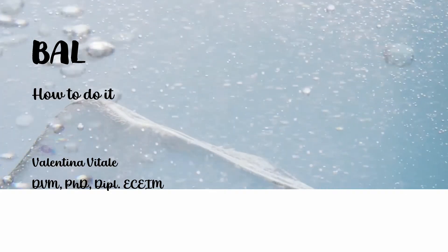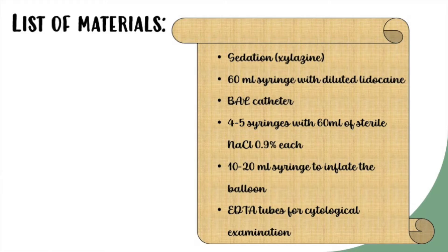So now, first of all, let's check what we need: adequate sedation — usually xylazine is okay — diluted lidocaine as local anesthetic, a BAL catheter, 250-300 ml of sterile saline solution in 60 ml syringes, a 10-20 ml syringe to inflate the balloon tip, and EDTA tubes for sample collection.